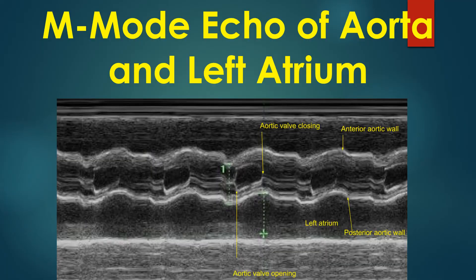Measurements of the left atrium are taken in systole while that of the aorta is taken in diastole. The open position of the aortic valve has the shape of a parallelogram, representing the movements of the right coronary cusp and the non-coronary cusp. The right coronary cusp is anterior and the non-coronary cusp is posterior. The closed position of the aortic valve appears as two parallel lines.